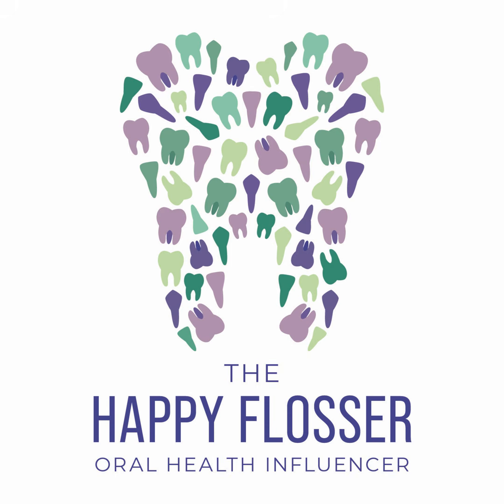Because when that alginate impression material is exposed to air, you can have shrinkage and distortion occur. So when it's exposed to water, you can have imbibition, right? You can have distortion. So you don't want to have those paper towels too wet either. So just a happy middle for both of those things.